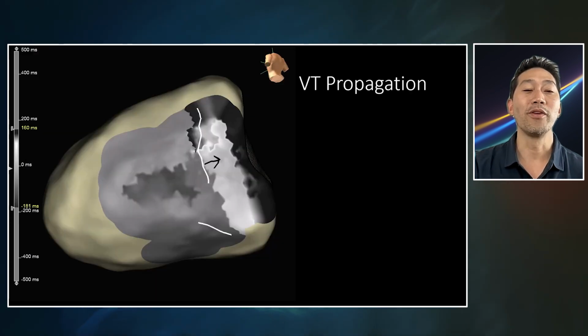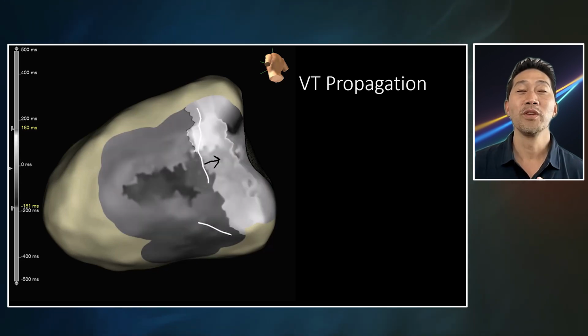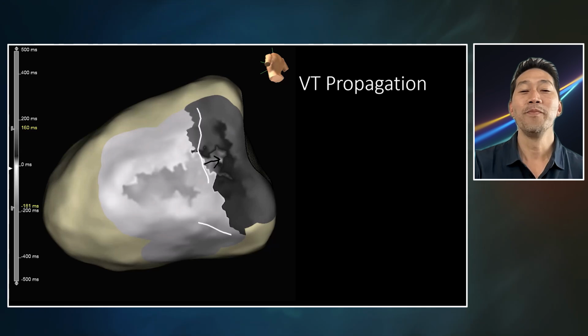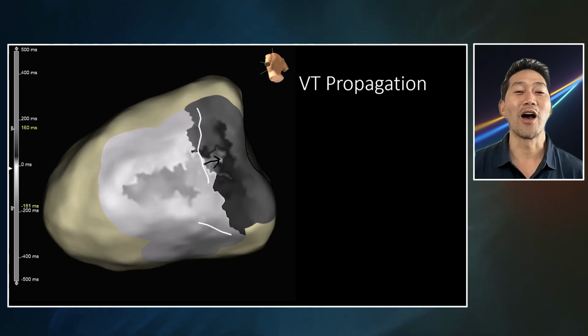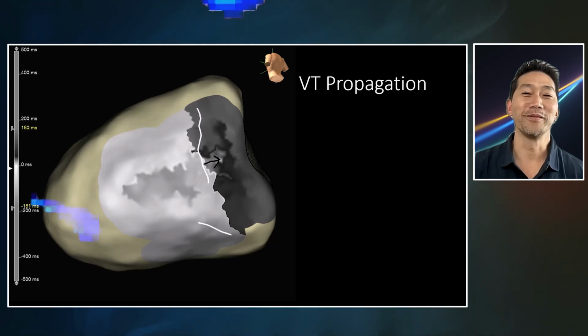What's important about this was that we were able to get a very brief activation map, even though the mean and the systolic blood pressure were about 40 and 60 respectively. But this clearly exited the basal portion of the inferior annulus. And we will leave you with some unseen footage about 5 minutes after we cut out of a beautiful VT termination at that site, where it then breaks out the mitral annulus, and you can see our joy when it happened. So thanks for this retrospective, and enjoy.